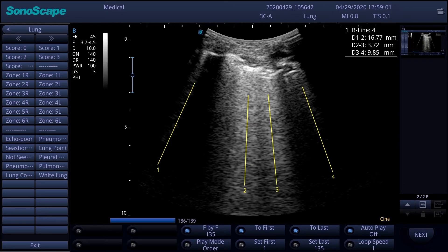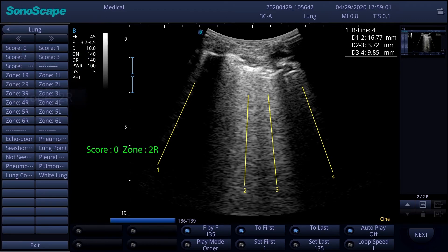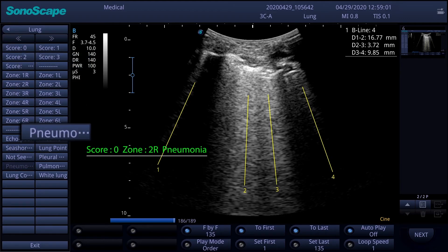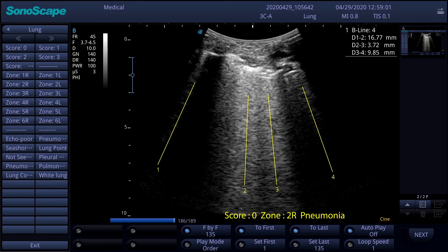A workflow of the lung annotation function can be like this. Depending on the selected sections and the diagnostic information, clinicians can save the score, zone, and clinical diagnosis information simultaneously, and save it anywhere on the screen by pressing set.